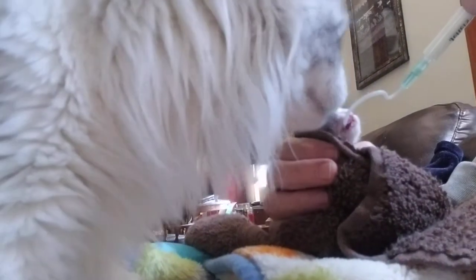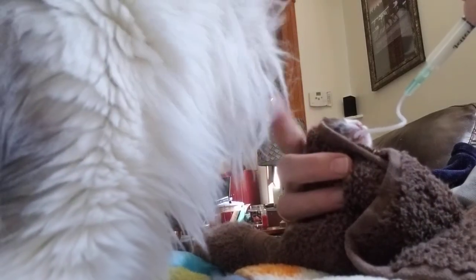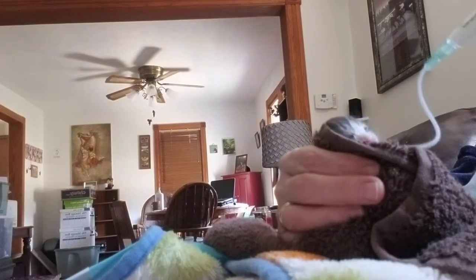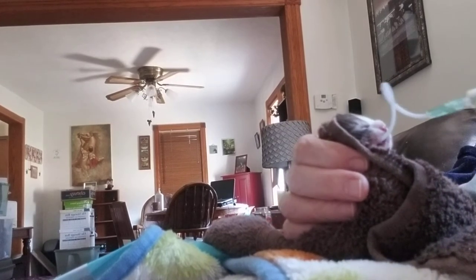Mama's coming to check me out, make sure I'm not hurting her kitten. No, Daisy. No. 1 cc is in. I'm going to give it a break. Hold on. Keep it in there. Hey, Daisy, move. Daisy, move back. Good girl. Okay, so. Yeah, it wants to get that paw up there to take it out. So you just gotta hold on. And then I'm gonna slowly add a little more.